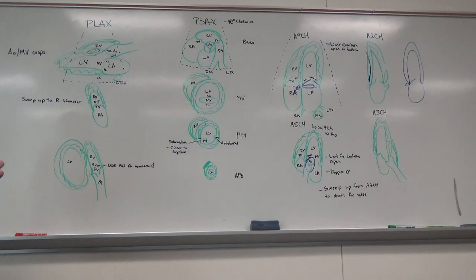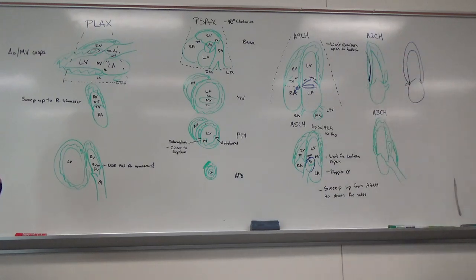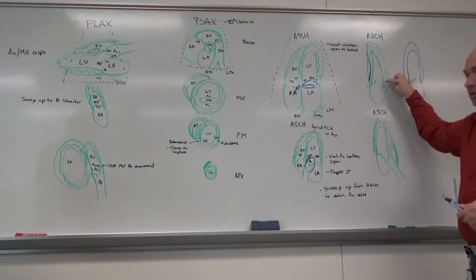So it actually takes what they call an inferior dip at the tip if you have a proper two-chamber view. If you don't have a proper two-chamber view and it looks rounded, there's either pathology going on or you're not exactly in the center of it. You're foreshortening the chamber. It should bow this way, and then the anterior wall typically goes out like this.